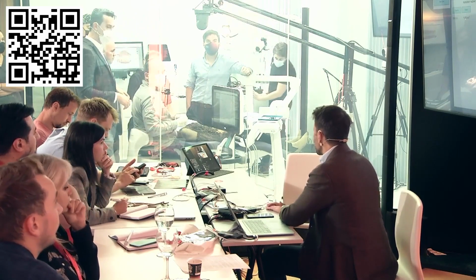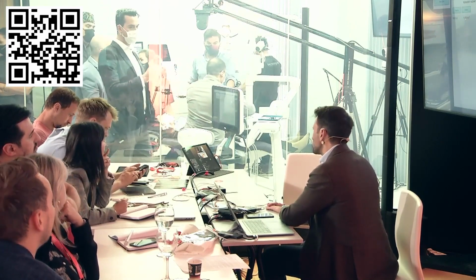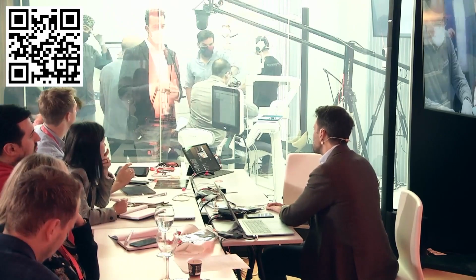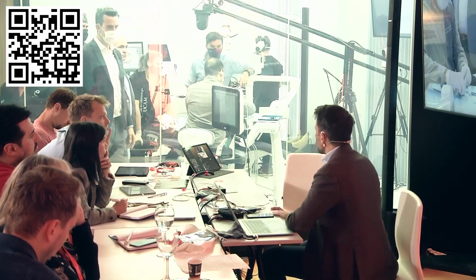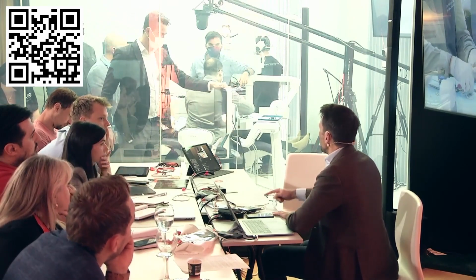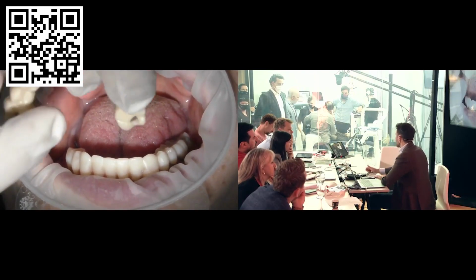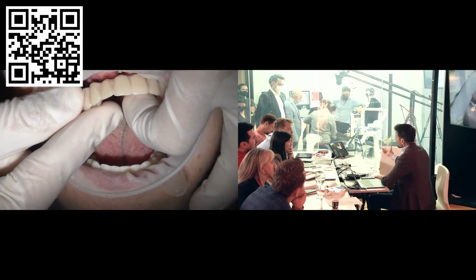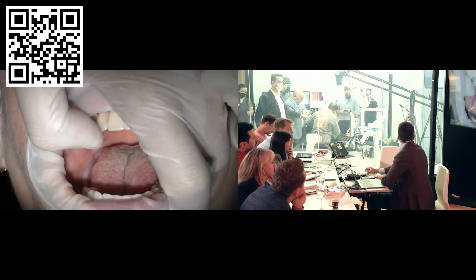Function, aesthetics, and passivity. Yes. 3. And then we have another one that is just for passivity, and we are going to simulate that we tried the passivity and it's not correct, how to fix it. So we did the demonstration of what would be a first appointment. Then we did a demonstration of what would be the first appointment after case acceptance. Right now, scanning the implants, after implant placement. And now we are one appointment ahead, that is getting back from the lab the test drive. Correct. That's exactly what we are going to do now.